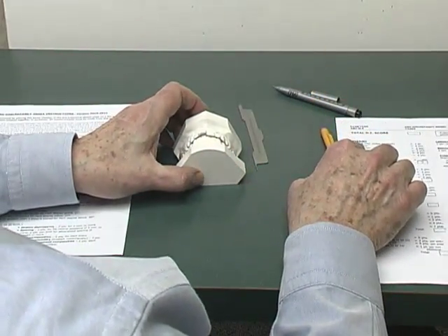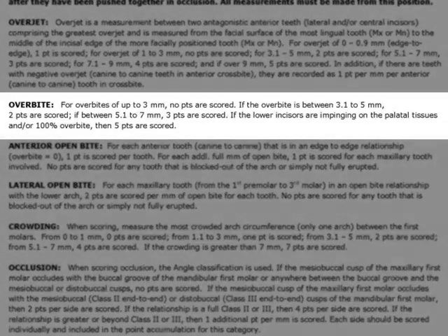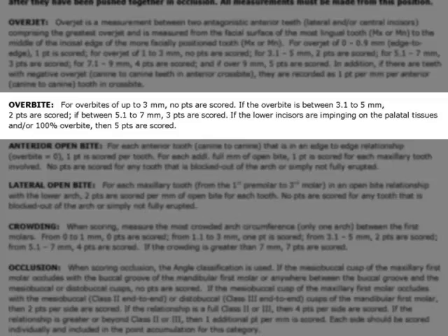Now we will move to the next category on the DI, and that is overbite. For overbites of up to 3 millimeters, no points are scored. If the overbite is between 3.1 to 5 millimeters, two points are scored. If between 5.1 to 7 millimeters, three points are scored. If the lower incisors are impinging on the palatal tissues and are 100% overbite, then five points are scored.